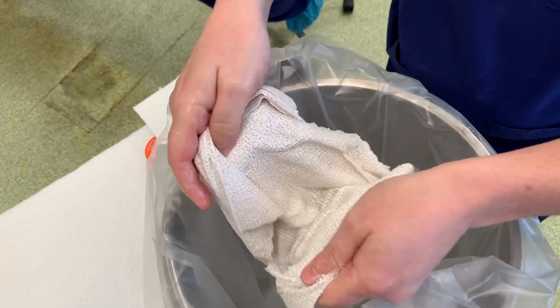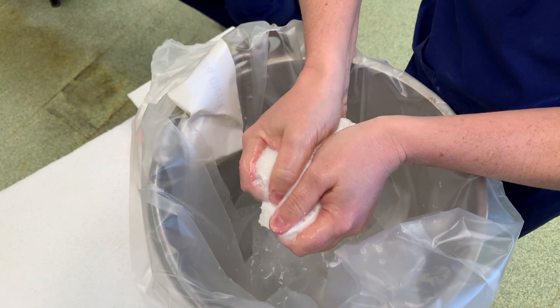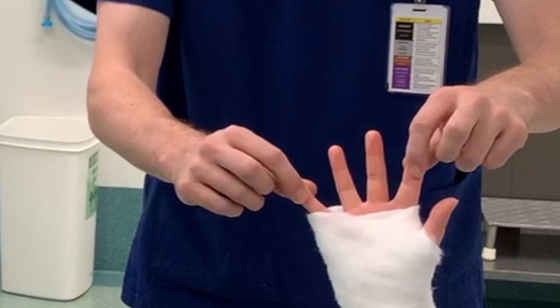Here is the plaster that we cut to template earlier. We're using cold water as it gives us a longer working time. We dip the plaster into the bucket full of water and then squeeze out any excess.